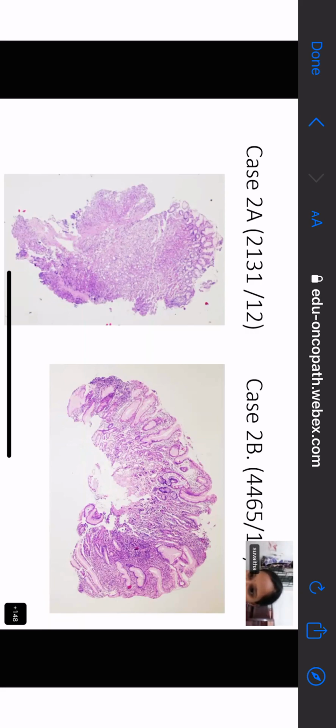Totally ulcerated. Show me the ulceration. Ask for annotation. Yes. Yeah, ma'am, this area. Where is the ulceration? Right. So you feel that there is some ulceration over there. Yes, ma'am. It's not just denuded, like it is seen over here, by the fact that it has been biopsied or some rough handling. Yes, ma'am, it can be a denudation. All right, good.